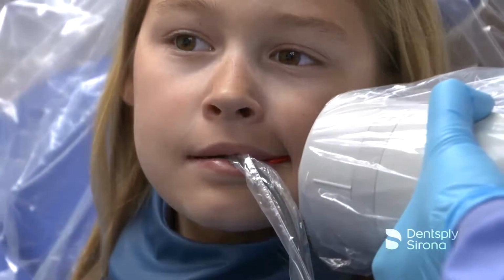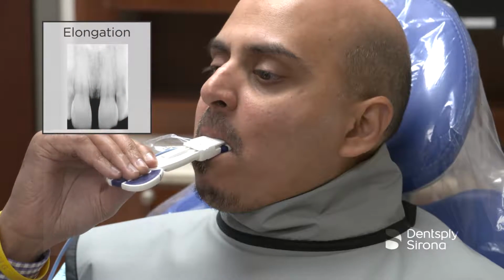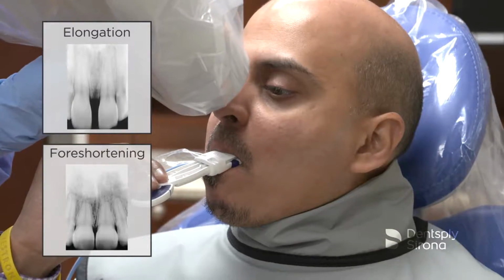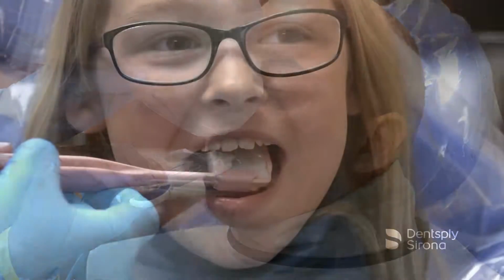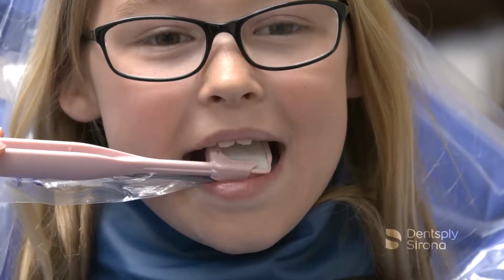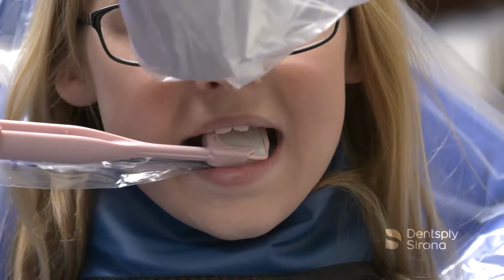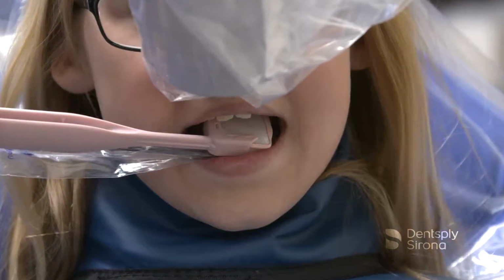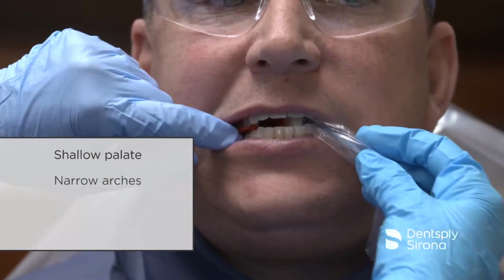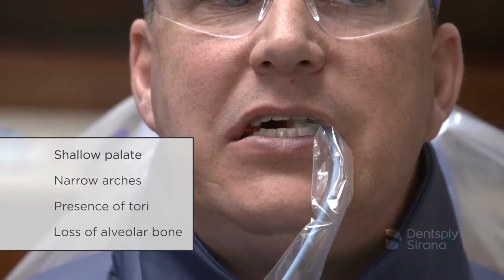This technique is more operator sensitive. If the angle is not correctly divided, elongation or foreshortening will occur. A variety of holders can be used for accurate positioning of the receptor in different locations in the mouth. Technique adaptations may be required due to anatomical considerations or to avoid patient discomfort. These anatomical considerations include shallow palates, narrow arches, the presence of tori, and the loss of alveolar bone.